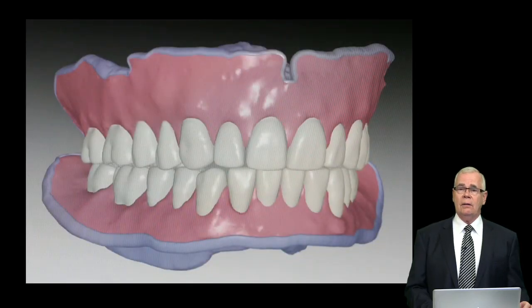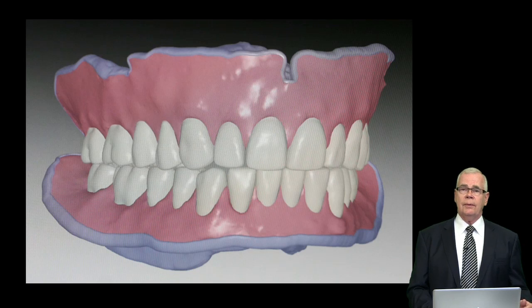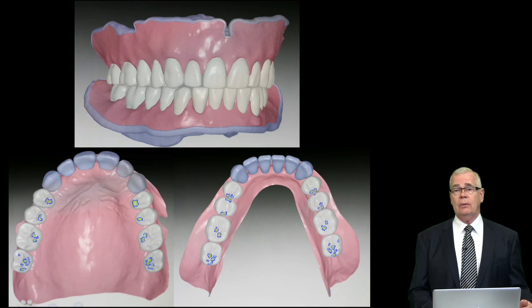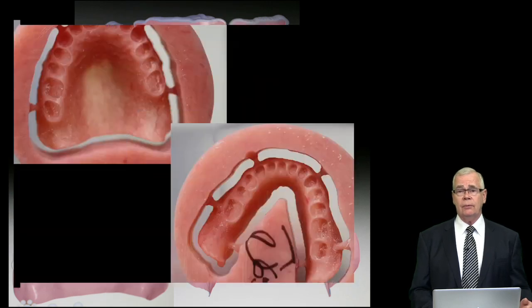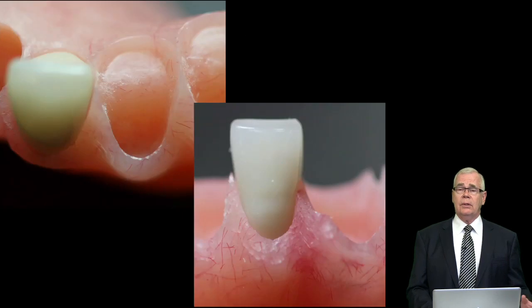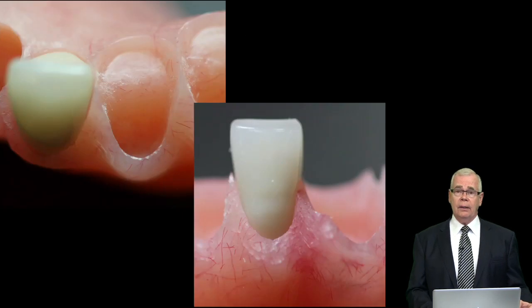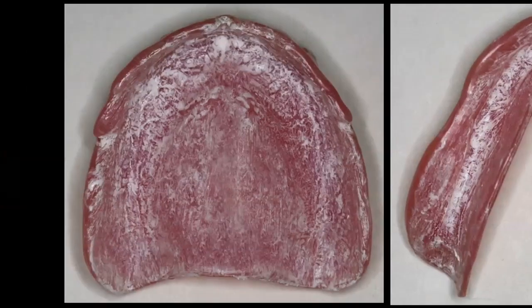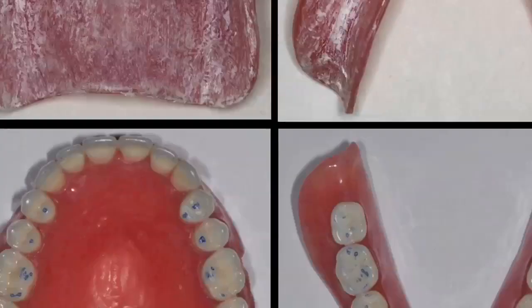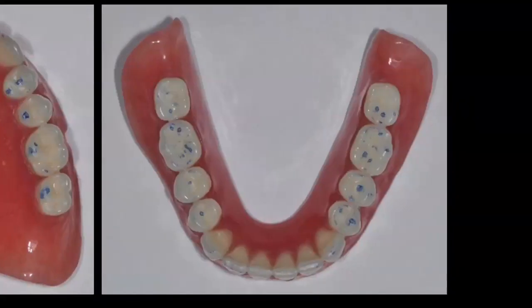After everything is scanned, the teeth are set in the computer, the base is formed, the occlusion adjusted to what we've specified — the type of occlusal scheme that we would like to produce — and denture bases are milled, into which teeth are bonded in position. This yields extreme accuracy from milled denture bases and a very appropriate occlusal relationship.